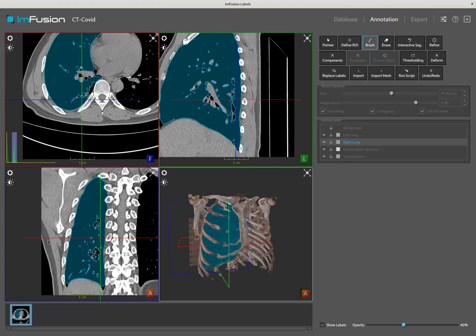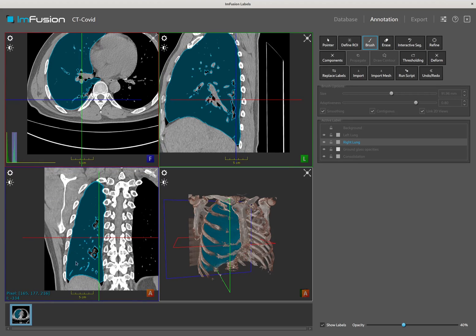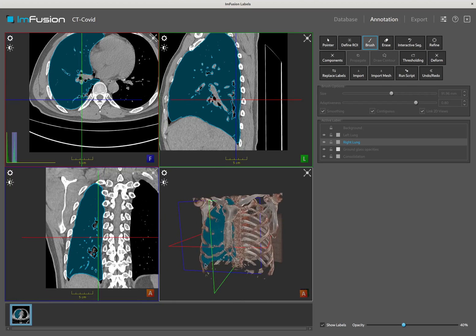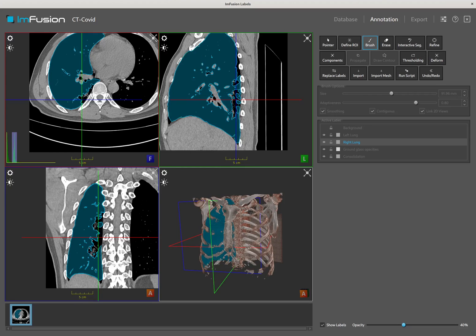The software also keeps track of all modifications made to the label map. At any point you can press Ctrl-Z to undo the previous changes, as well as redo them.